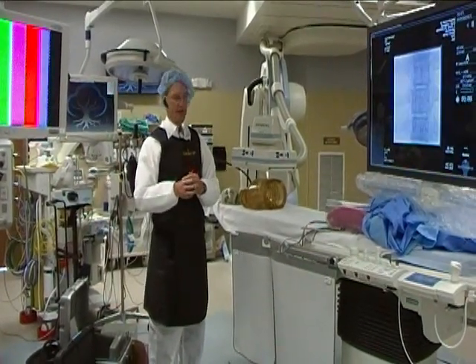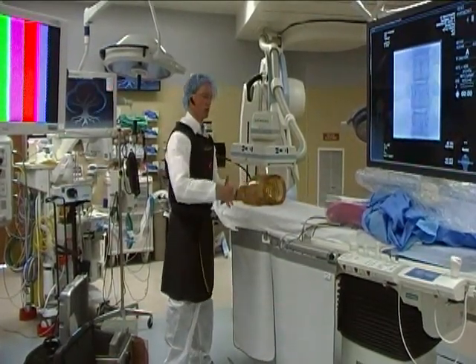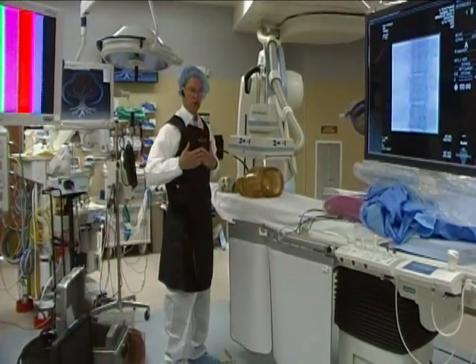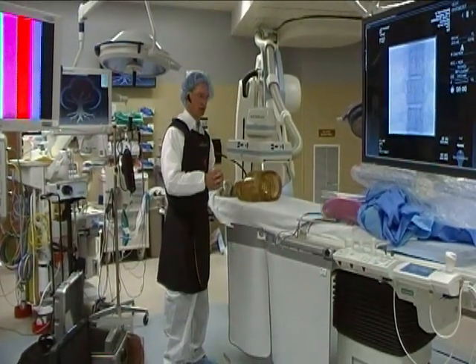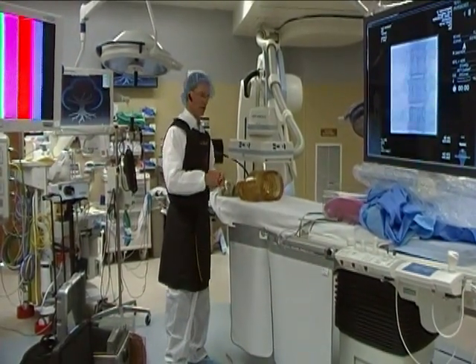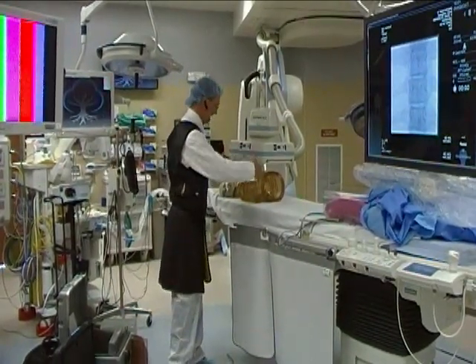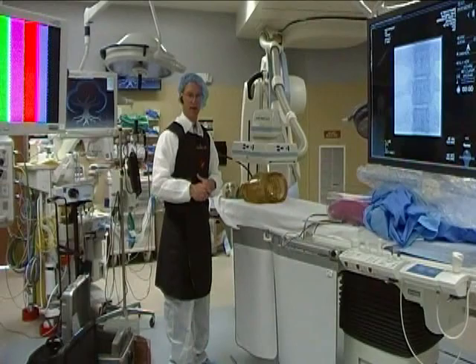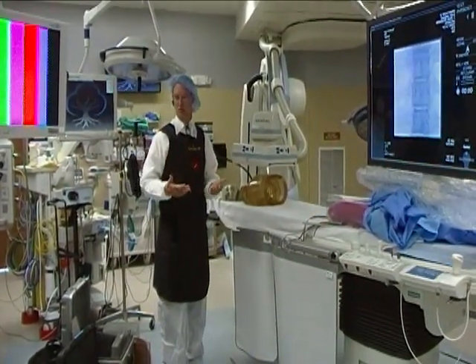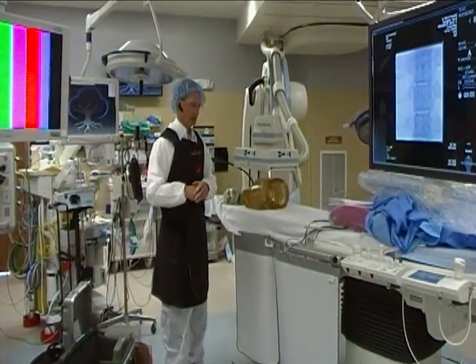Exposure levels that you're expected to get in a cath lab like this: if you are working close to the patient like this, without counting for the attenuation of your lead aprons, you can get close to the limit. The limit is 5,000 millirem a year, or 1,250 in a quarter. And standing, working in a busy cath lab right here, you can get close to that. Now, they're wearing aprons, so they're getting 2% of that. So it's nowhere near those levels.